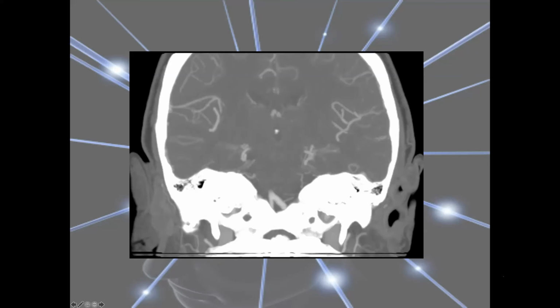Just another question. When using a CT blood window, do we still have to administer contrast? Yes, you have to use contrast. If contrast wasn't injected here, we wouldn't see these vessels. They'd be the same intensity as the brain cells, brain parenchyma. Yeah, good one. Good questions. Very impressed. Okay.